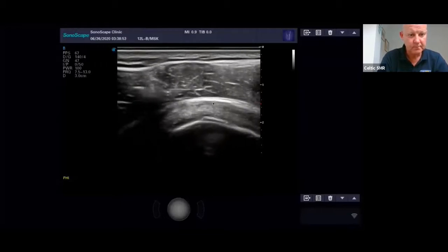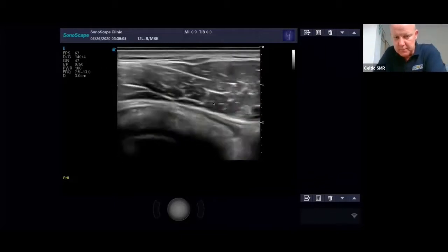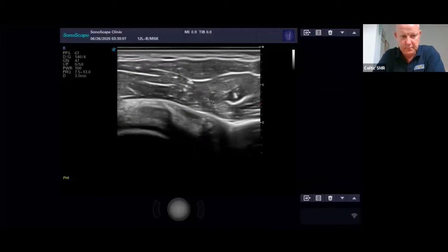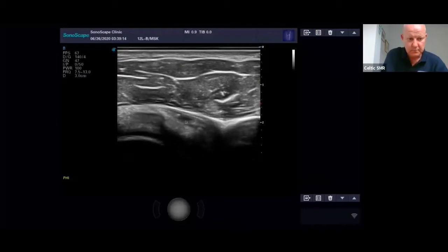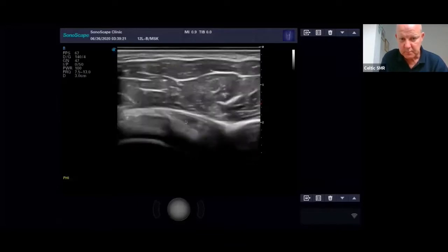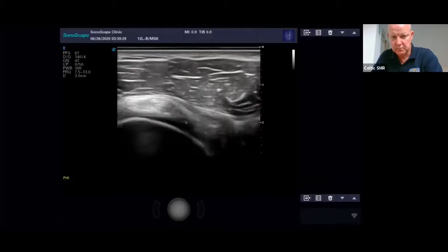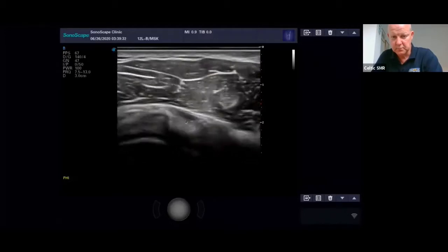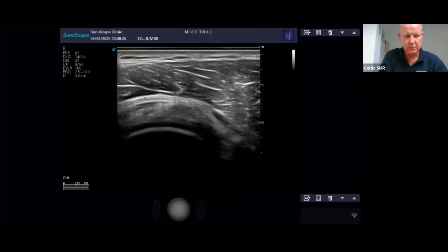And the other question about pressure. It's quite difficult to do it from this one because you haven't got any fluid. We have a bit of fluid there. If I press, you see that's gone, and it comes back. Just by pressing too hard, you can basically say, oh, that's fine, there's no fluid there. But if I release the pressure, the fluid comes. So it's got a little bit of fluid here, and you can see the bursal margin quite nicely, and that's all there with the fluid.